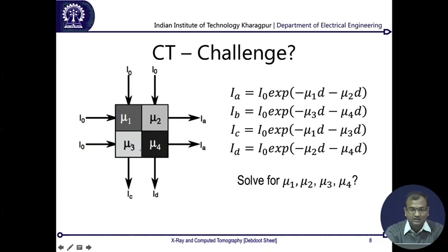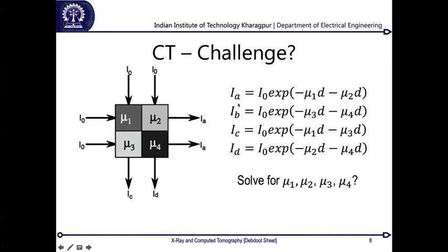But unfortunately these are all dependent equations. If you arrange this into a matrix, you would see that the determinant of this will never come out as non-zero. You will get a zero determinant, which makes this an unsolvable set of equations. So 2 equations are basically dependent on the other 2 equations. That's what comes down.